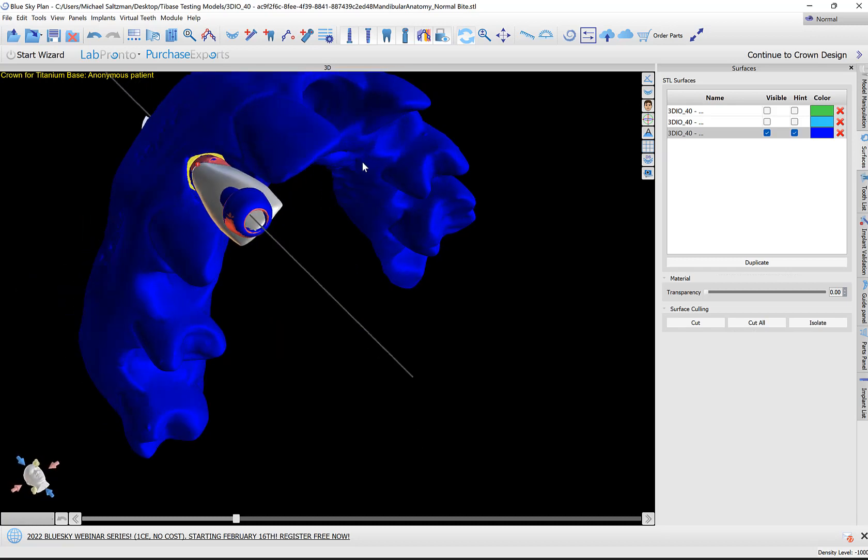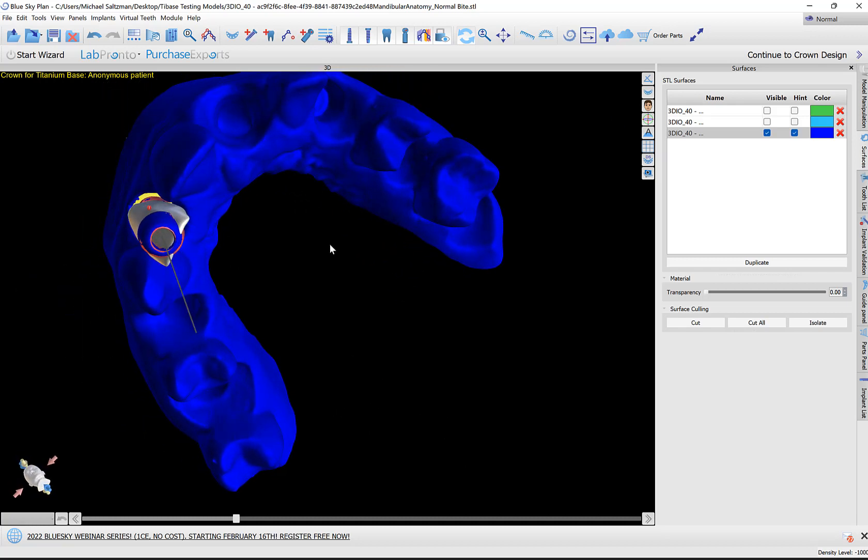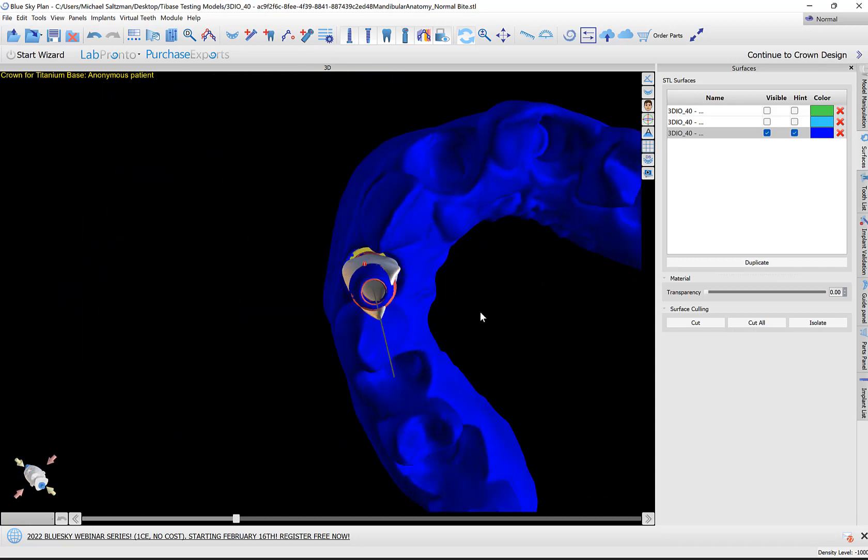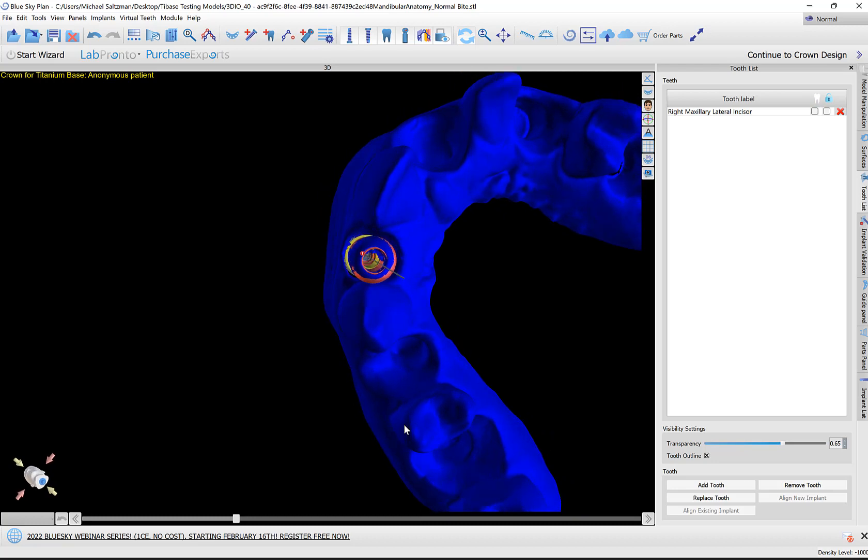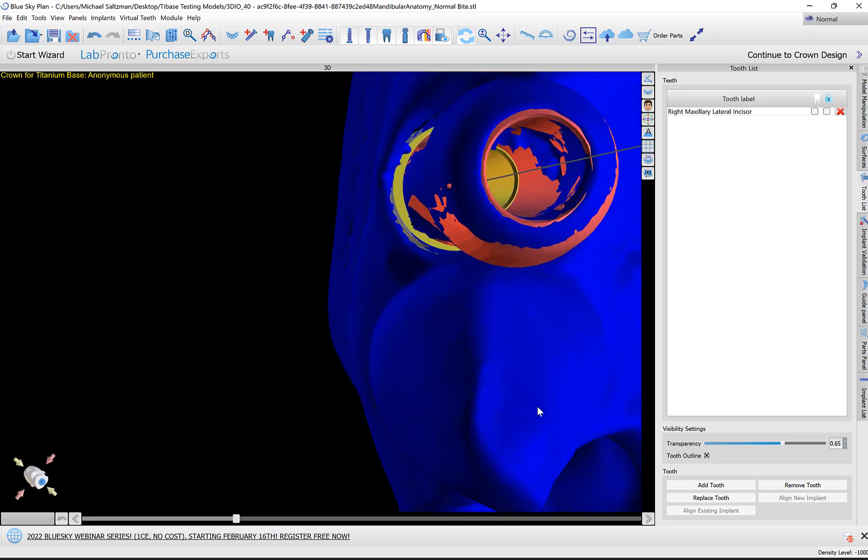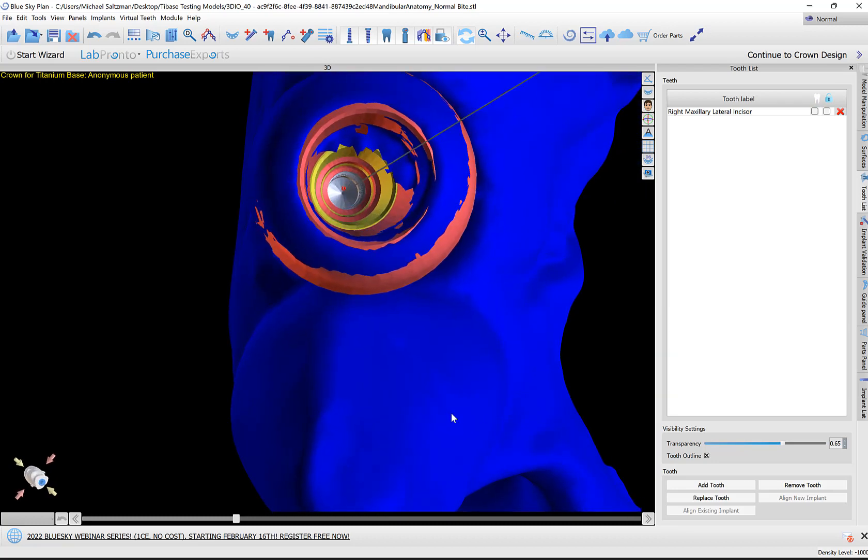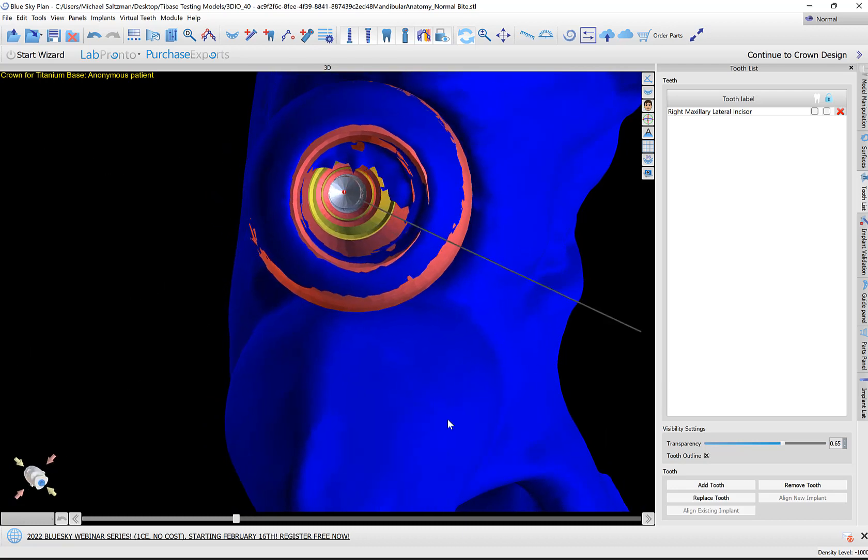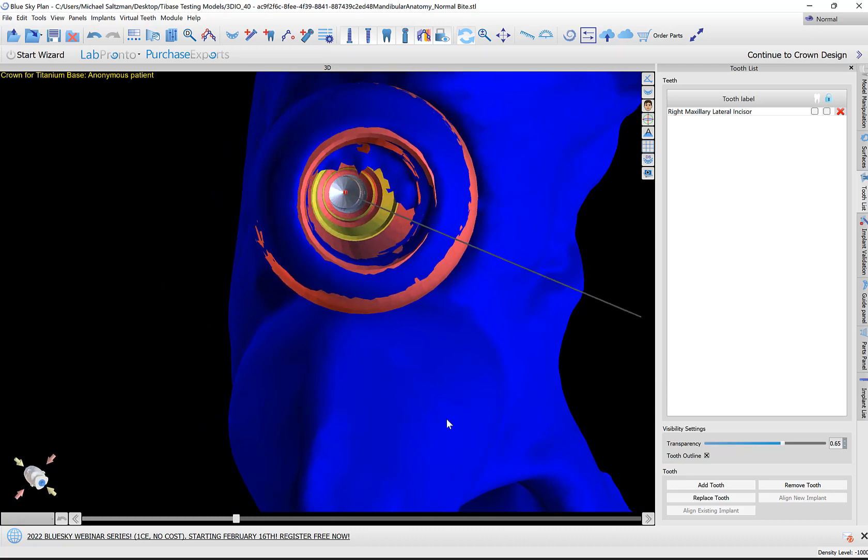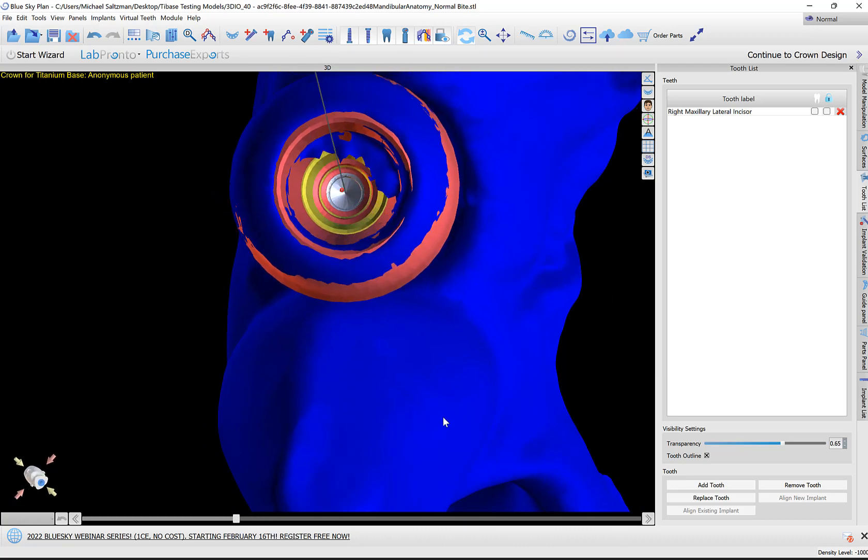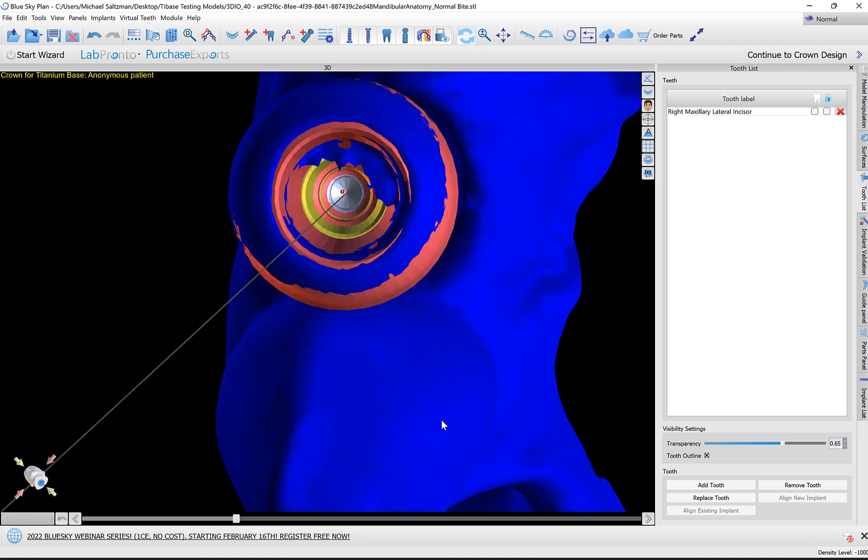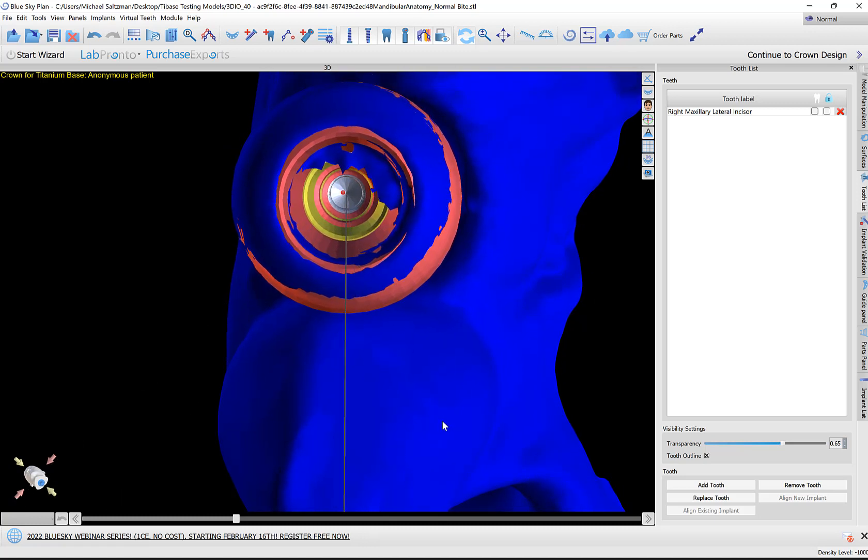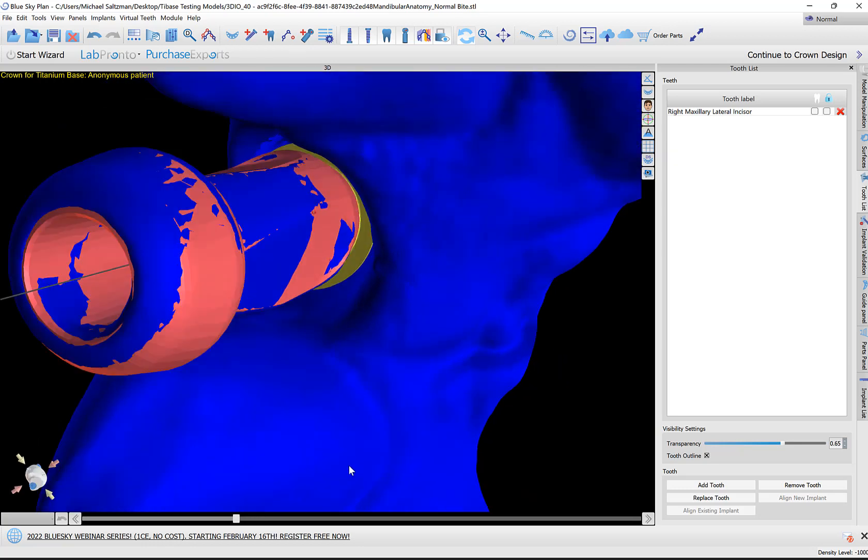Before we proceed, let's take a look and confirm our scan body alignment. I'm going to hide the tooth by clicking on the tooth icon. We could zoom in here and look how those inner circles of the scan bodies are aligned via the vertical axis of the implant. I think the alignment here is quite good.